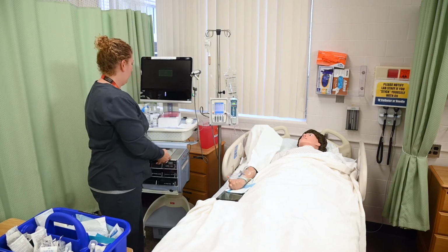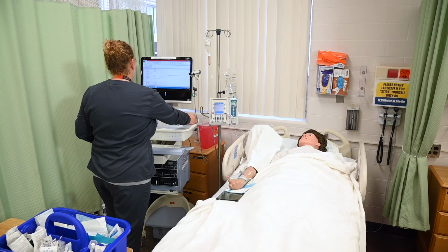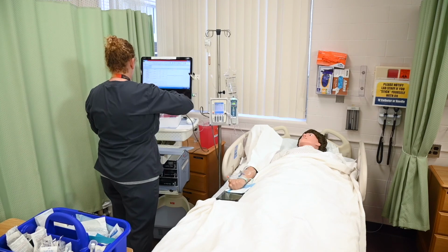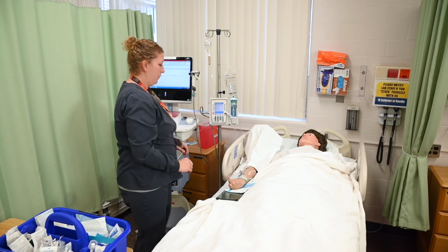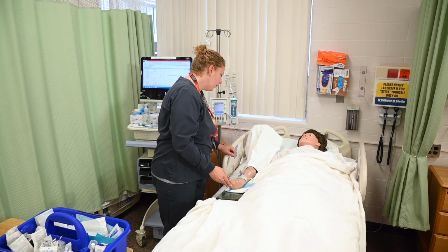Document medication administration on the MAR, 6th right. Scan your ID badge. Observe the patient's IV site for infiltration and stay with the patient for the first several minutes to observe for any adverse reaction.